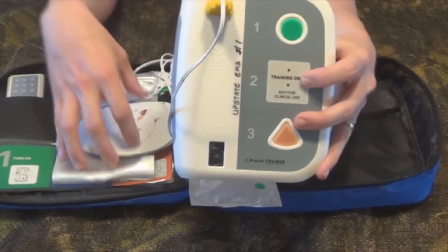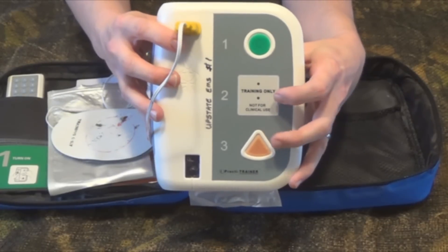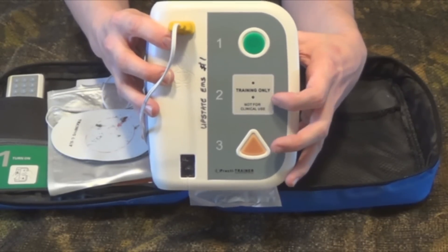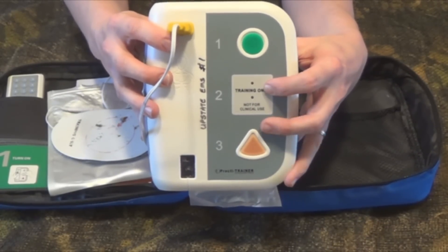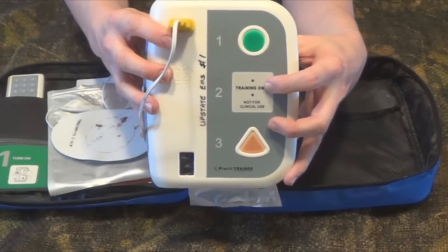This one automatically started analyzing once it picked up the pads placed and we had everything plugged in, but some of them you have to push an analyze button. It will be clearly stated that you need to push the analyze button. Do not touch the patient while it's analyzing — it may pick up a false positive.